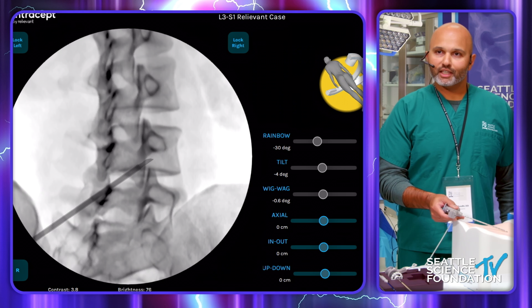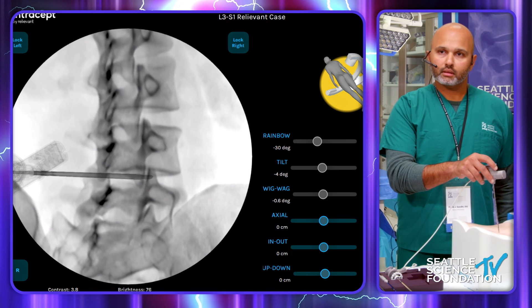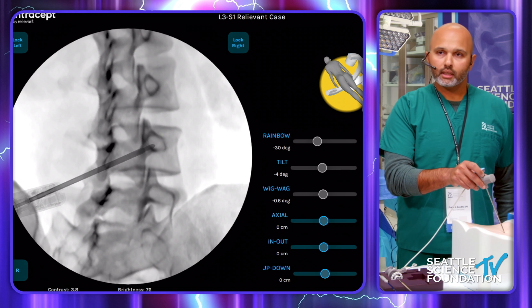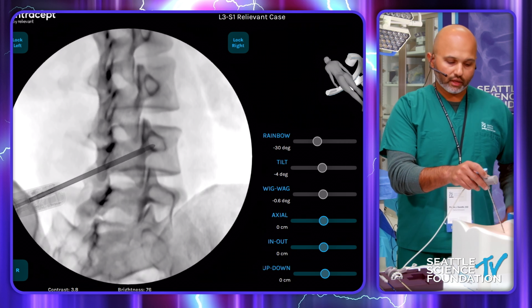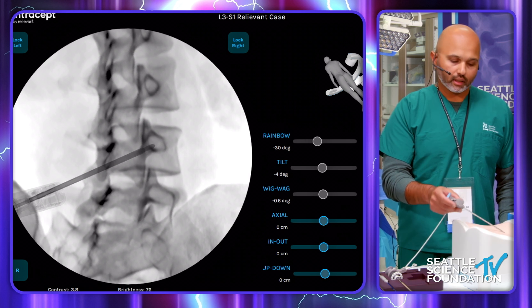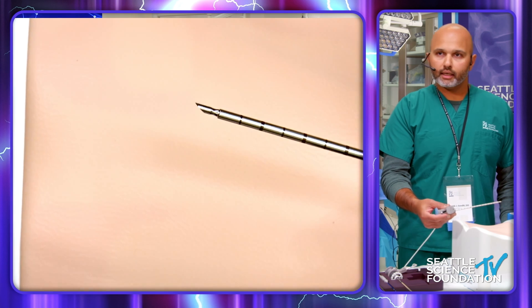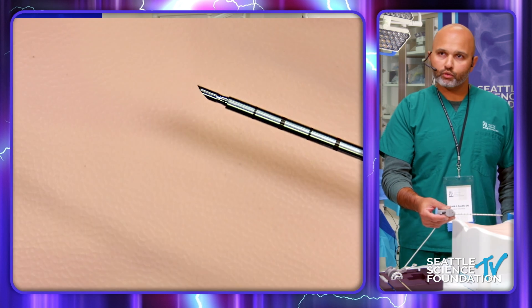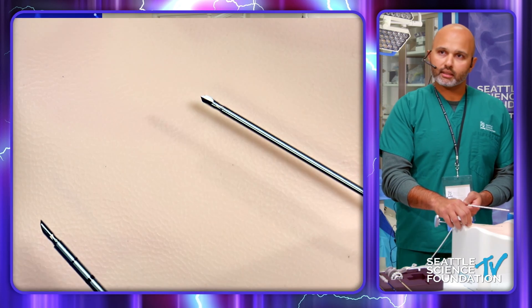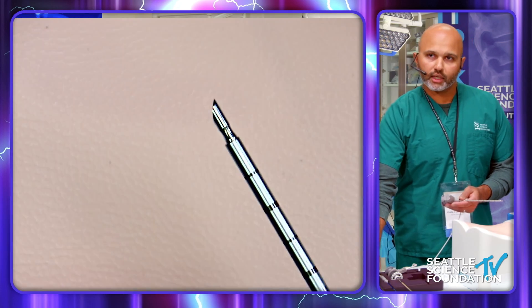We have a metal bar under the table causing some interference. Our access point is going to be to numb down to the ostium of the pedicle right down the middle. You have two options for needle introducers: one with a bevel tip and one with a diamond tip. The bevel tip gives you more directionality and ability to carve through bone if you need to make moves up or down. The diamond tip is classically used for pedicle access as well. I usually use the bevel tip to give me more directionality when doing the case.